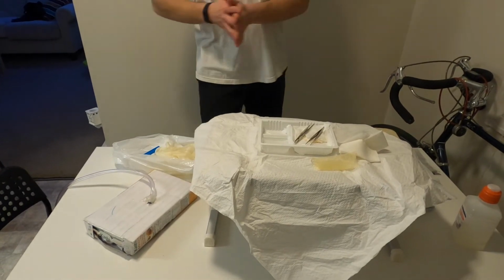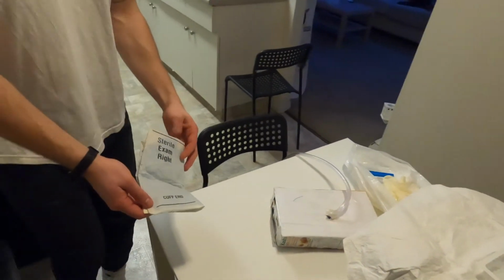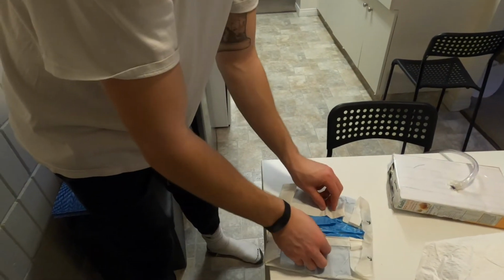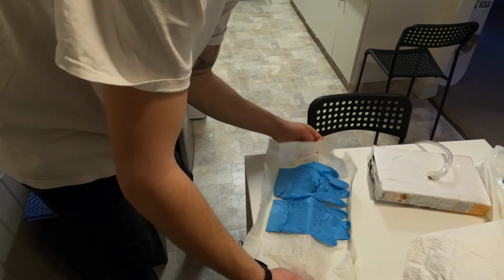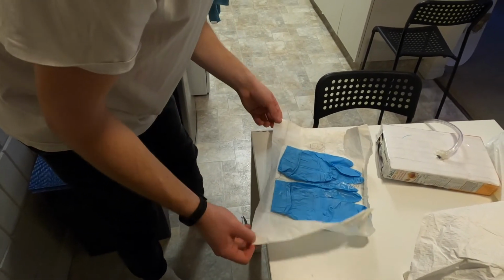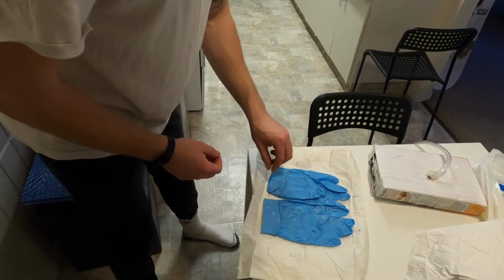So I'm going to come around to the other side of the table there because that's the only place I have space. So again, perform hand hygiene. I'm just going to move the patient a little bit too. Lack of space here. And just making sure I only touch on the edges here. Fold this back, it likes to fold over itself.